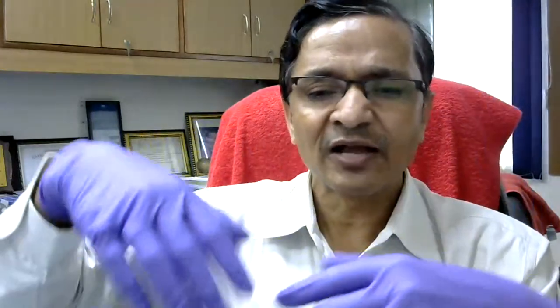If a smaller size is used, it will be too tight, I cannot work. If I use a large size, it will be too loose, and many wrinkles will be there, so it will be difficult for me to handle anything. So these are fitting gloves, and then I will start working.